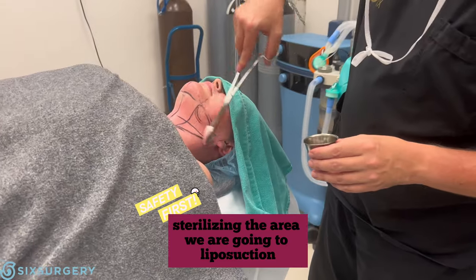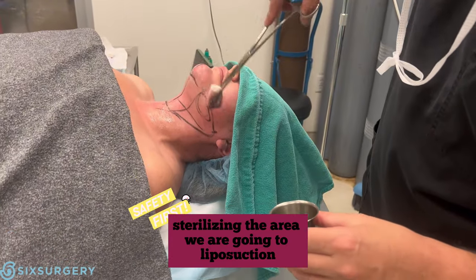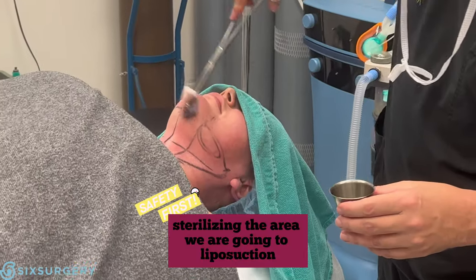Next, we're going to clean the area up with an antiseptic solution. This clear, invisible solution kills all the bacteria and makes it sterile — sterilizing only the surgical area, not the whole body, just the surgical area.